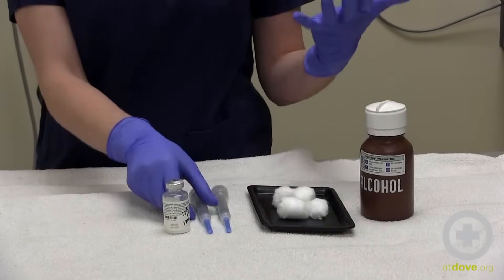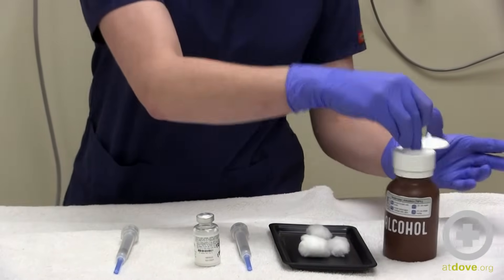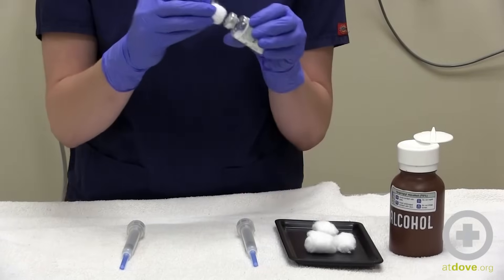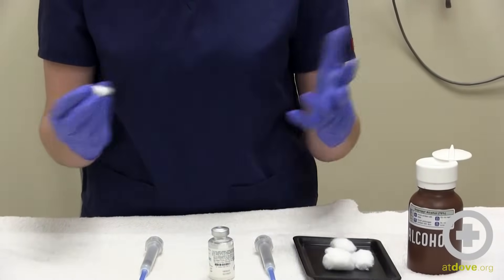So I'm going to get my medication, take my cotton ball, and get a little bit of alcohol on it. I'm going to use that and rub the top of the bottle so that it cleans off anything that might be there.